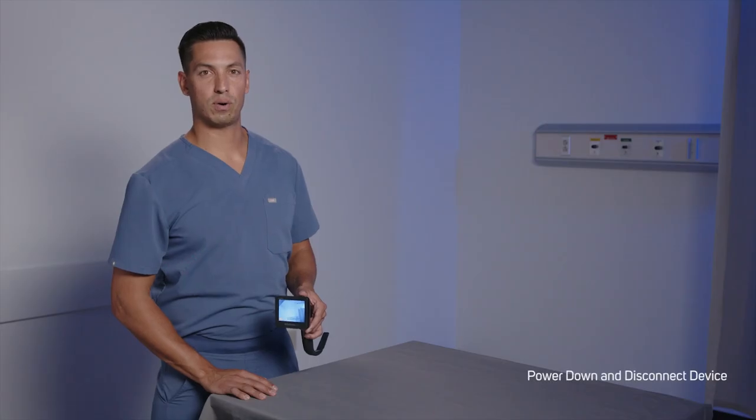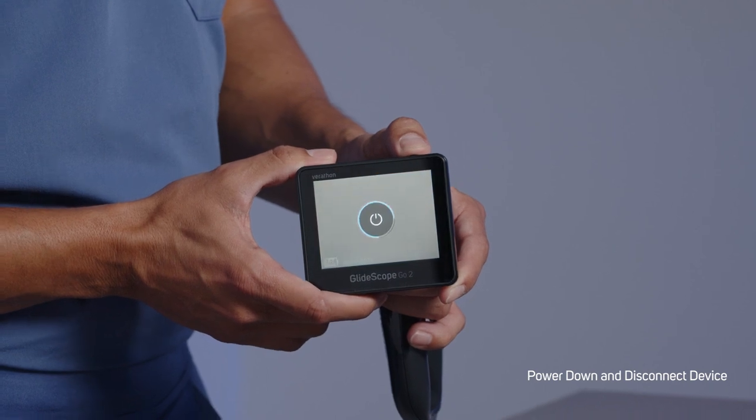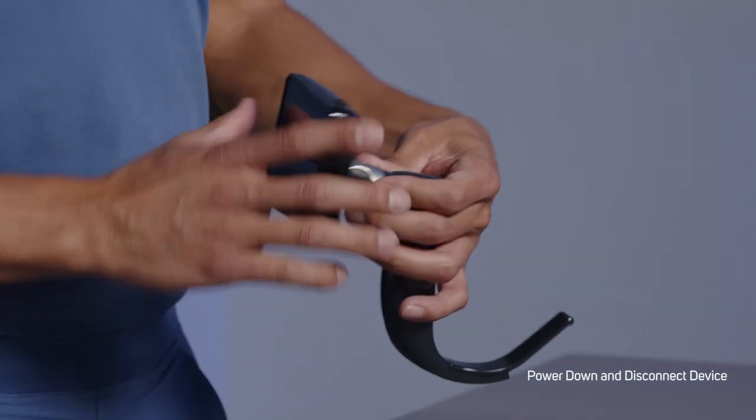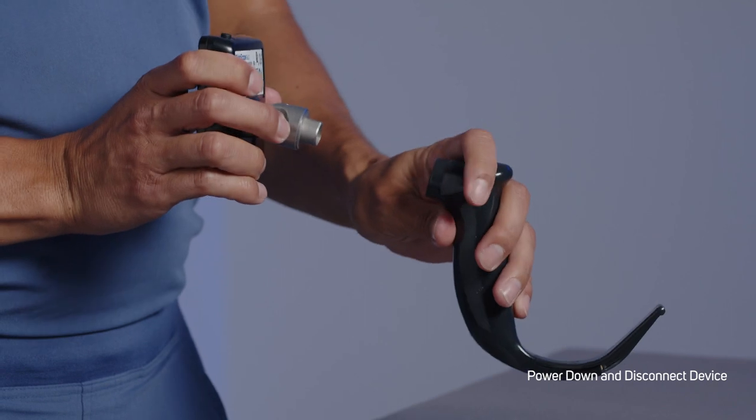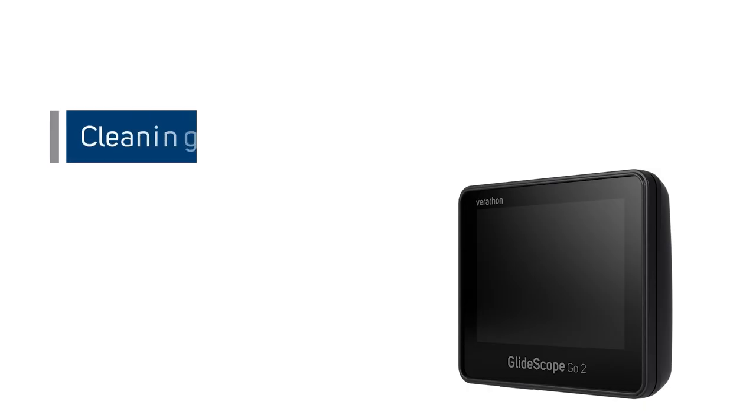Power down the Go 2 monitor by holding the power button down for three seconds. Disconnect the video laryngoscope from the Go 2 monitor by firmly pulling the two apart. The GlideScope Go 2 monitor can be cleaned with select wipes or submerged in a cleaning solution. The GlideScope Go 2 charging cradle can also be cleaned with select wipes. Please review the GlideScope and GlideRite products reprocessing manual for approved cleaning solutions and instructions.